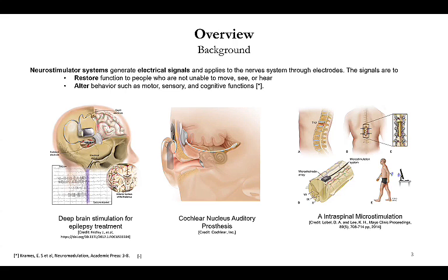Please continue. Okay. So in the middle figure, we see the cochlear nucleus prosthesis. In this common application, the idea is primarily bypassing the ear and placing a microelectrode array in the sensory region of the brain stem, and then it delivers electrical stimulation pulses there. And the very right figure is the spinal cord stimulation. It is most commonly used for stroke patients or rehabilitation applications.